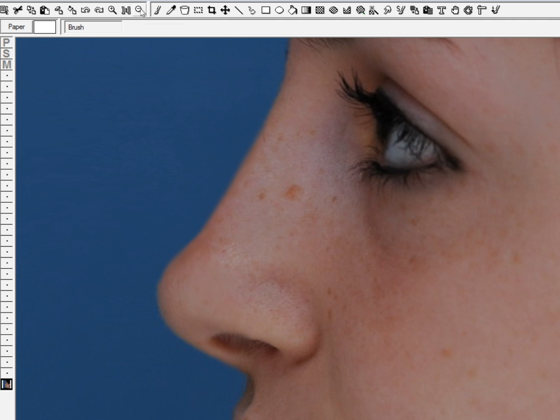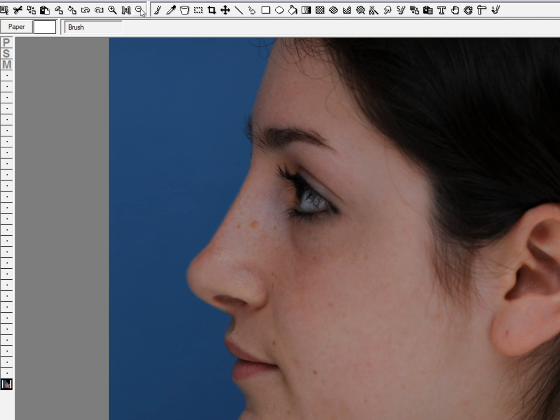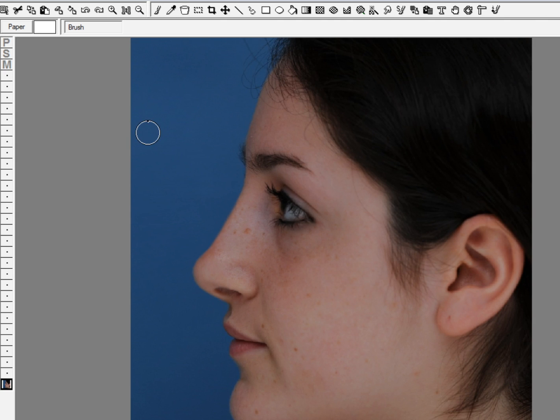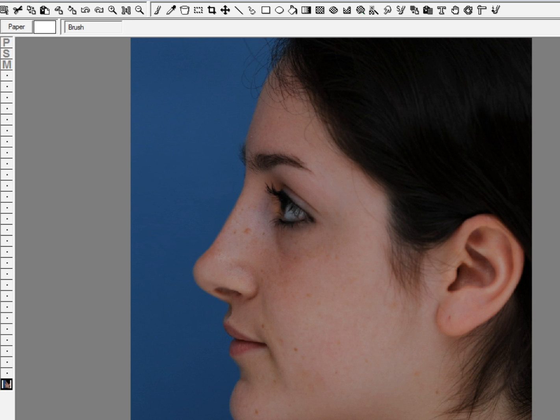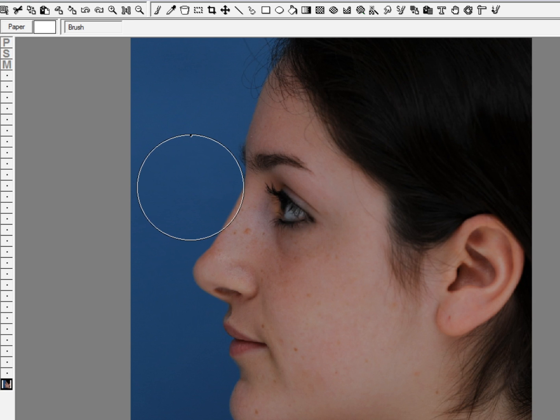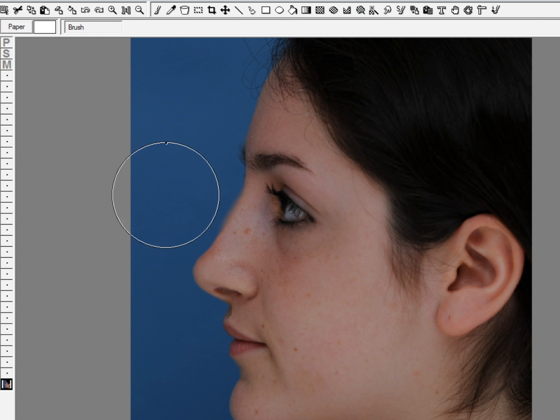And at this point we'd say to the patient, well what do you think, do you like that or do you want to see a little bit more, and we could play with bridge height. For example, she might say well that looks really pretty, or she might say well what would it look like with the bridge a little bit lower, and if she liked a little bit lower we could show that.